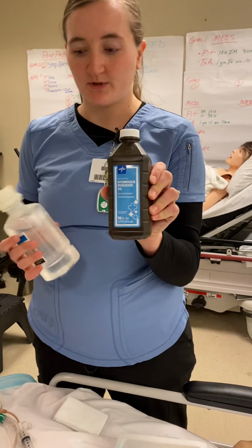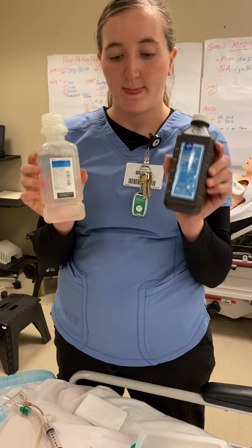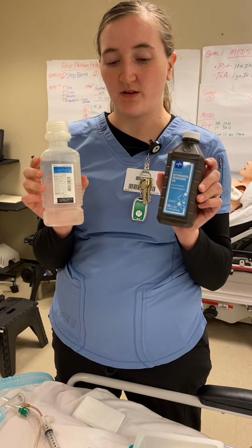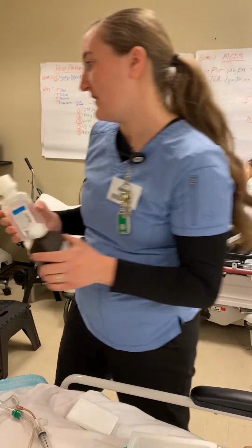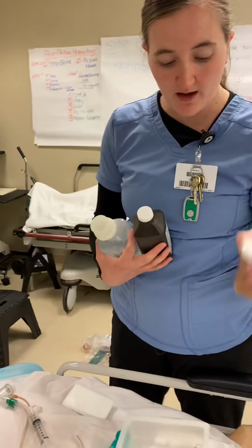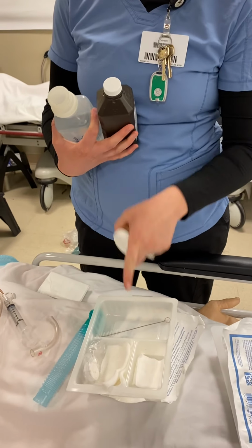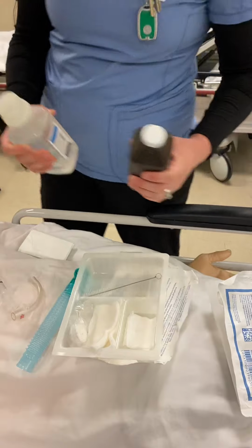You're going to grab hydrogen peroxide and sterile water, and you're going to do a half and half mix. Make sure you discard any that you don't use at the end, because hydrogen peroxide turns to distilled water in light. So I like to get a sterile, clean sample cup, or you can use your tray in your trach care kit as well. And you're just going to pour half and half, okay?